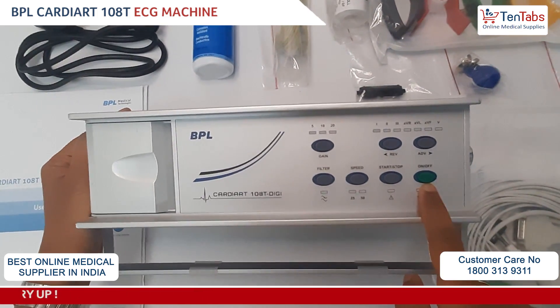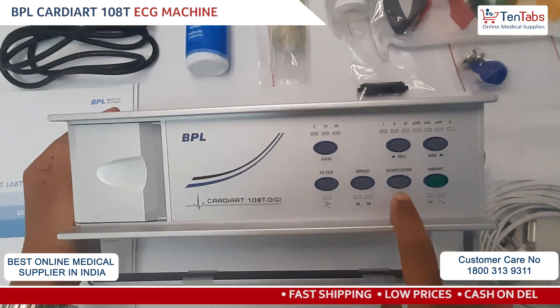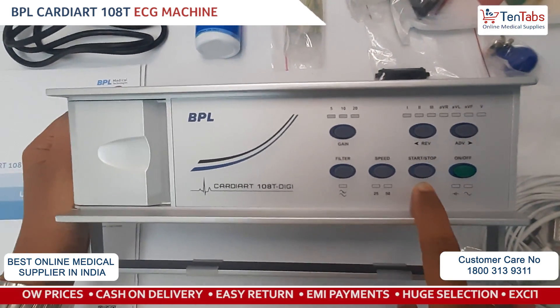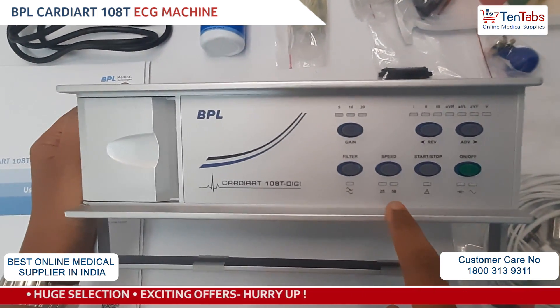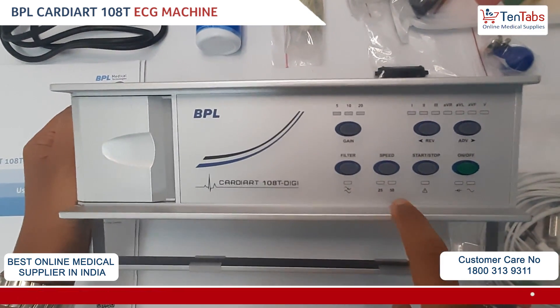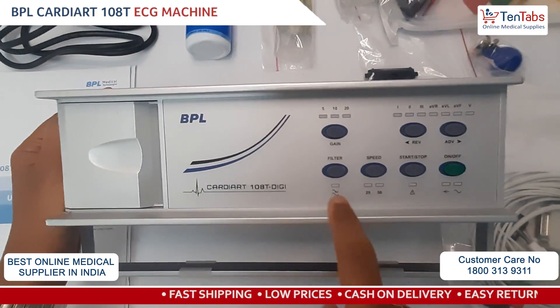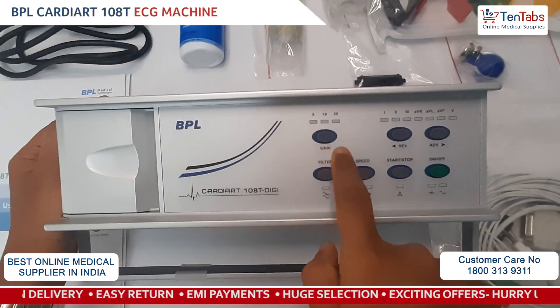Coming to the front operating controls: this is the on/off button — when you press it, the device turns on or off. This is the start and stop button which does the printing job. Next is the speed, which determines your paper speed: 25 mm per second and 50 mm per second.